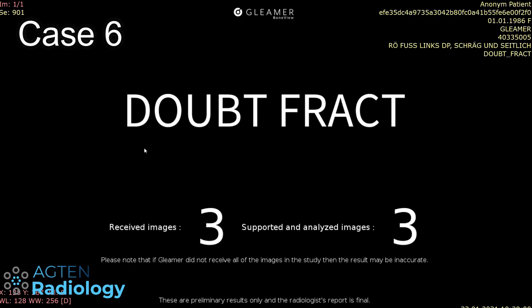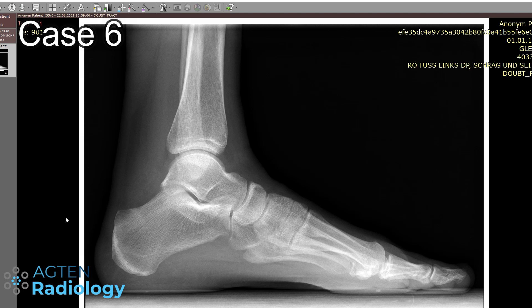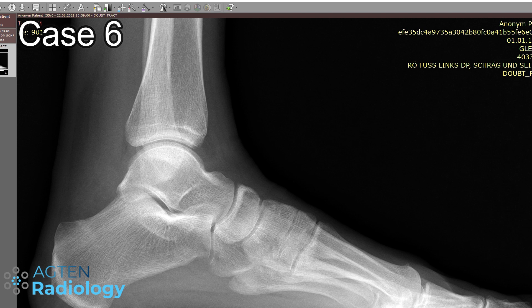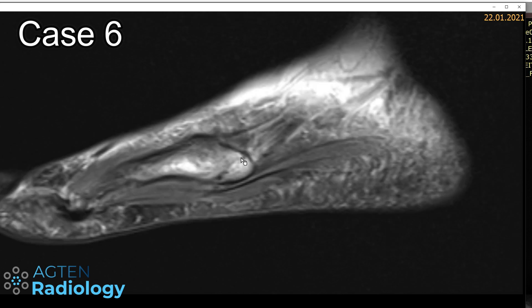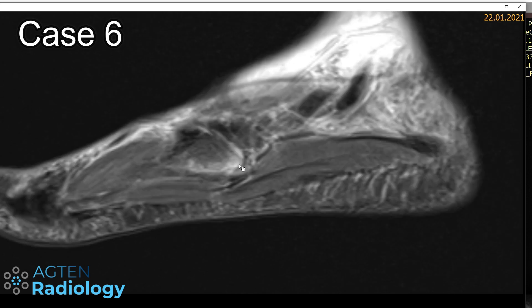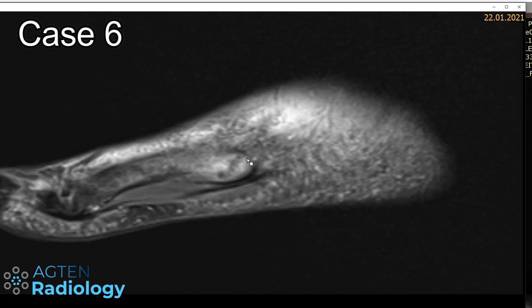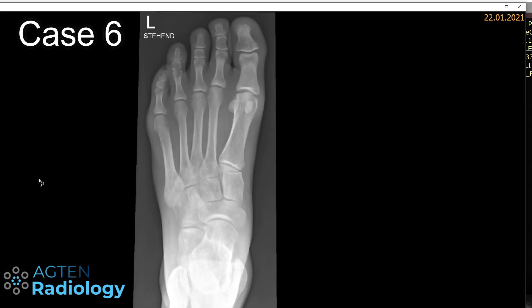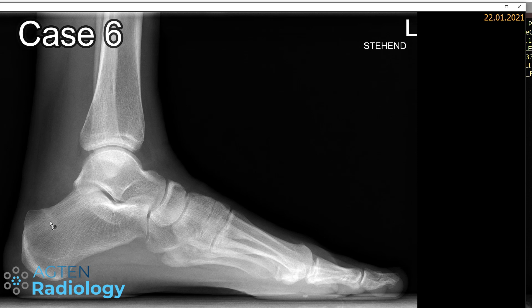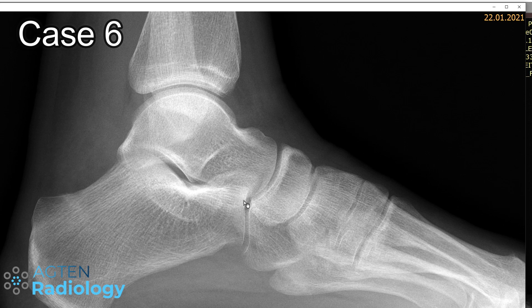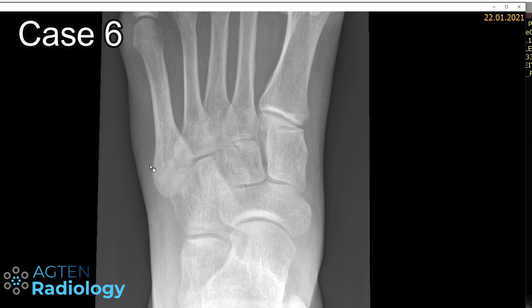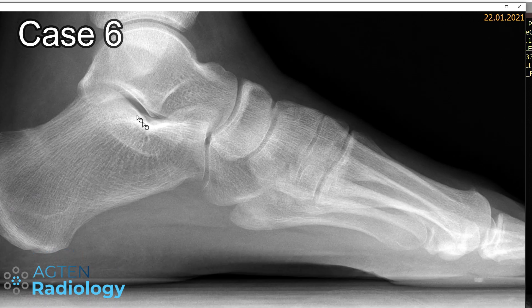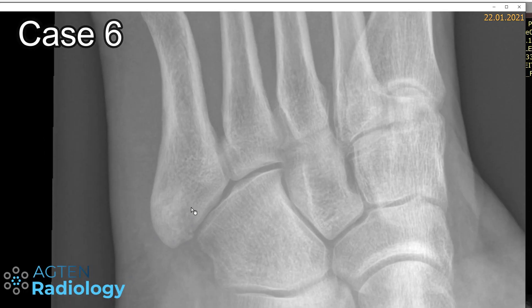The algorithm says: doubtful fracture. That's actually a fracture I might have missed myself. Going back to the original case, you can see all the bone marrow edema. I think it's very impressive that they detected this. What happened with me was satisfaction of search — I was just seeing the main finding and didn't remember this case had two findings on this image. The only sign is that the bone density is a little bit higher than the other bones, and the trabecular structure is a little bit hazy with just this irregularity. So it's really good that the algorithm picked this one out.